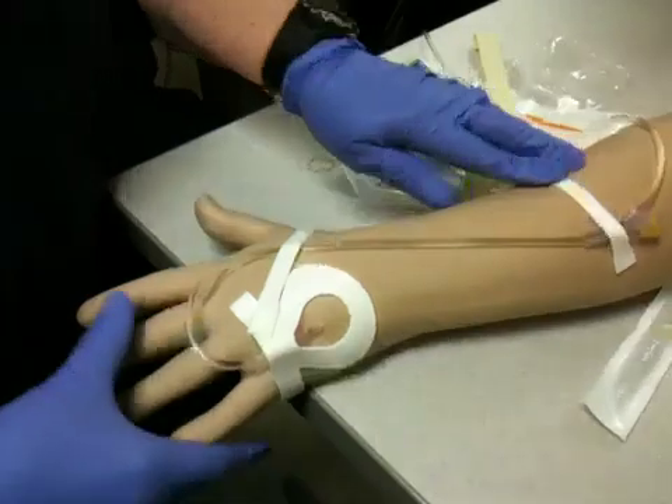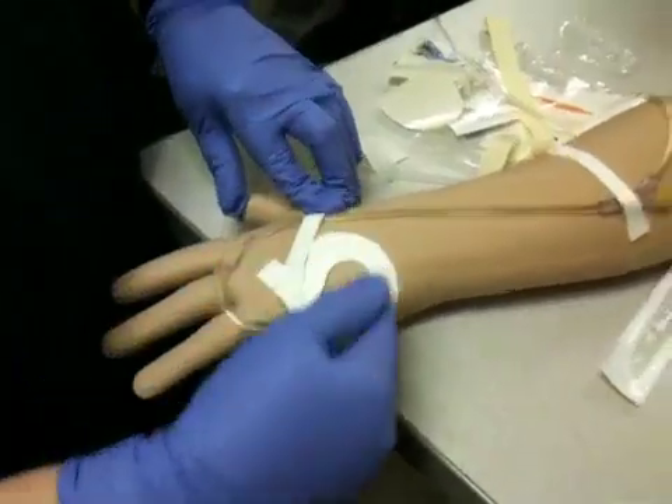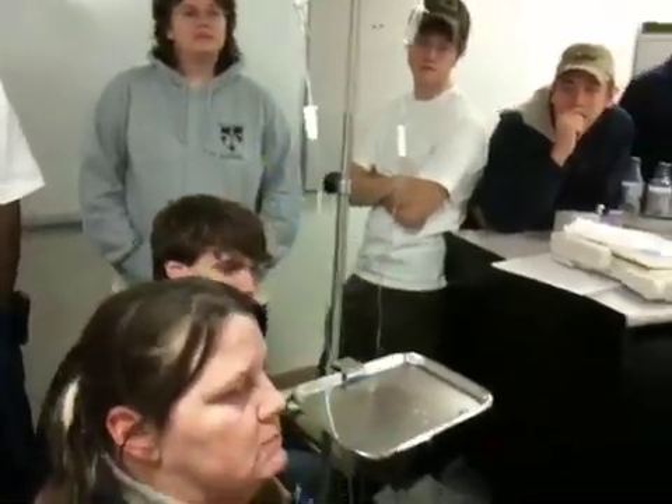Now I want to make sure that I don't have any infiltration or any swelling, any redness, any bleeding in this area. Now I'll go back and regulate my flow to where I want it to be. Any questions?